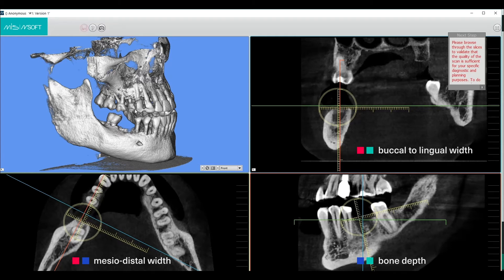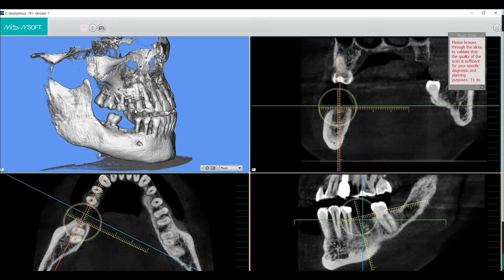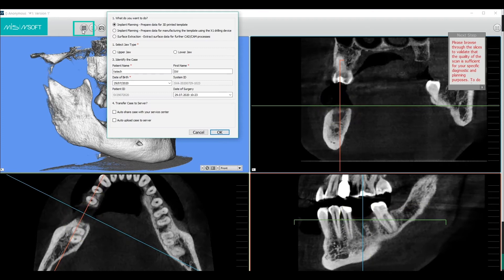Once we have verified that there is sufficient bone volume for the implant, and that the CBCT is done according to the protocol with sufficient field of view and no patient movements, we can press the flashing purple save button on the upper side of the screen. If for any of the reasons mentioned above the data is not acceptable, do not save the plan and exit.